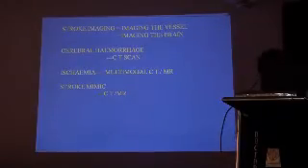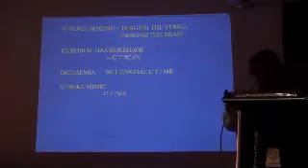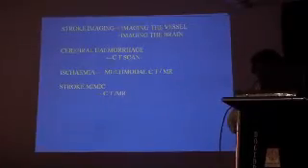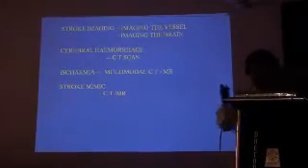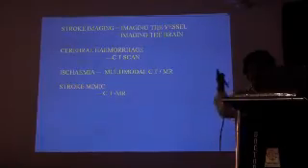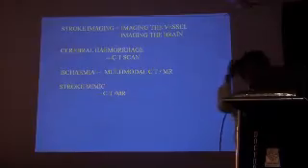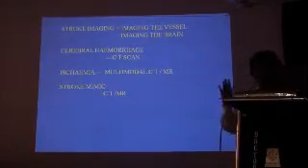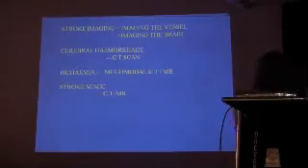If you suspect cerebral hemorrhage, or any patient with stroke, the patient should have a CT first. If you don't see hemorrhage, put the patient in MRI. If the patient comes within 3 hours, put the patient in MRI, do diffusion weighted imaging, and go for thrombolytic therapy. The patient will be safe and will walk out straight. Of course, there are certain limitations.